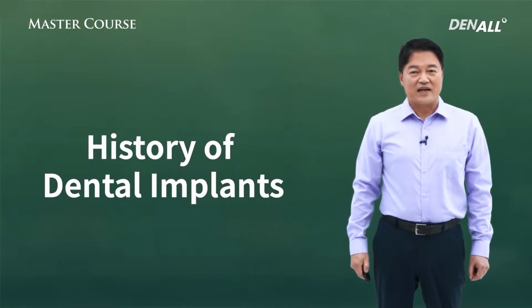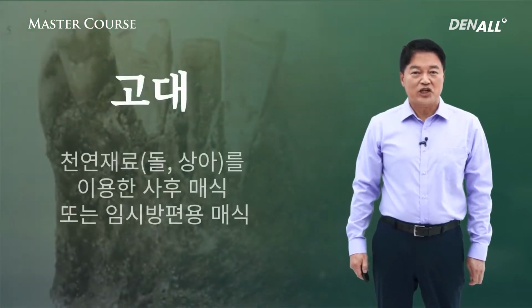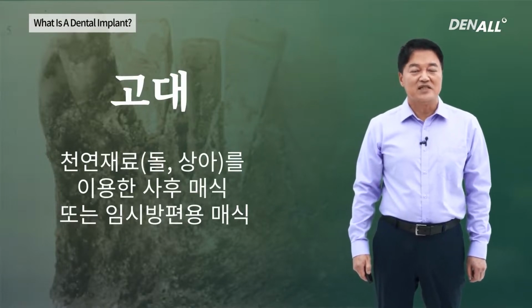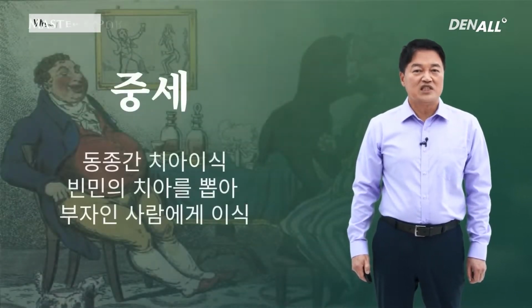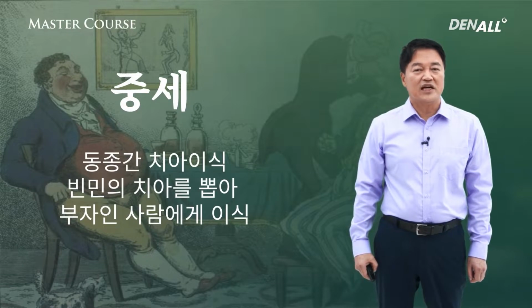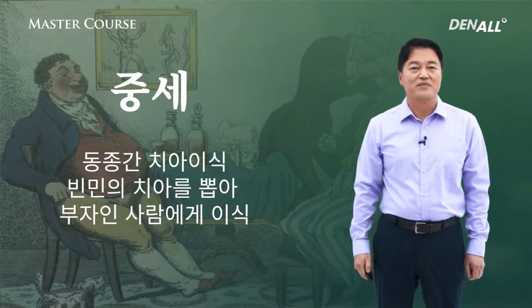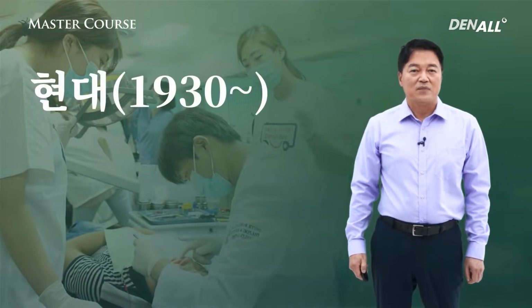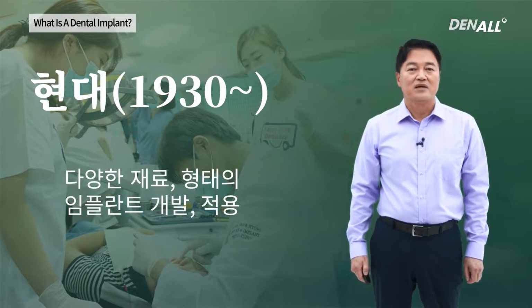History of dental implants. Let's look at them briefly. In the ancient days, rock and ivory was used, on the dead or as a temporary measure. In the medieval days, it's kind of funny, but teeth from another person were used. In other words, a tooth of a poor person would be taken out and transplanted on the rich. In my opinion, I think it had a very low success rate. Modern day implant. Let's look at history. It started from 1930s. Multiple materials and shapes of implants were used and developed.